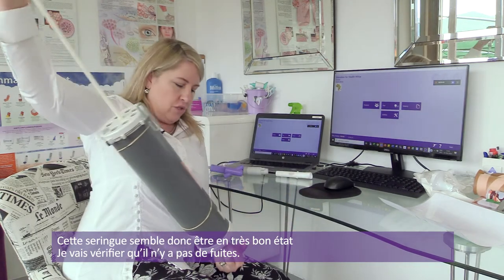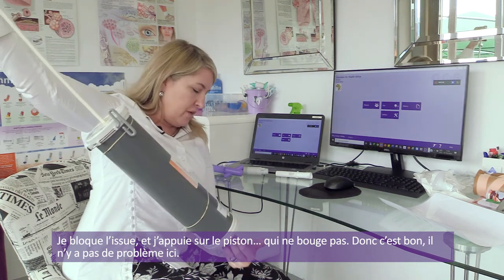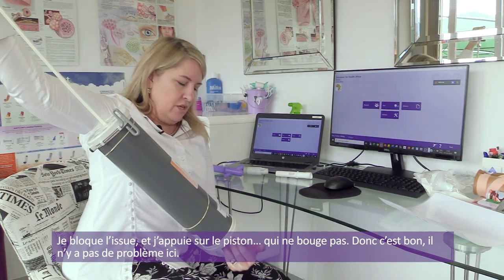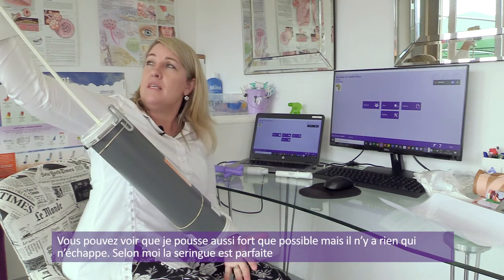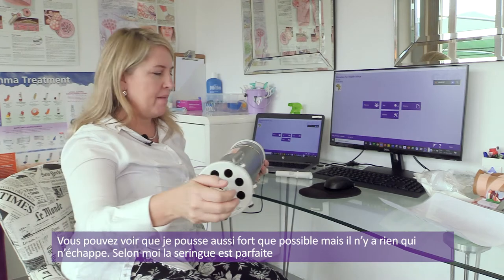Let me check for leaks. I would occlude the outlet, push in the syringe handle — there's no give. There's no issues here. I'm pushing as hard as I can. There's nothing leaking. So I'm happy with the syringe.